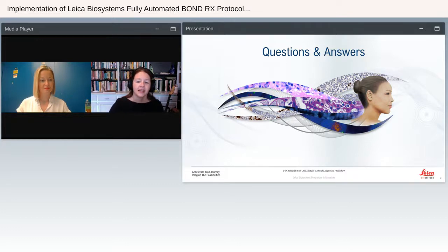Thank you. Next question. Can we use it for mitochondria function analysis? Let's see. I personally have not used it for any type of mitochondrial function, but certainly the gene list exists, and so I don't see any hindrances to why it would not work. You can't get down into the single cell phenotyping, but if there's specific pathways you're looking for in a general area, you could definitely utilize the DSP for that type of information.